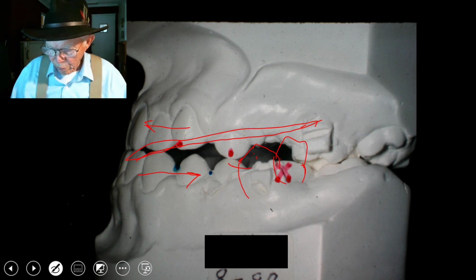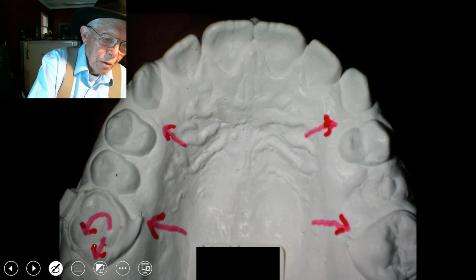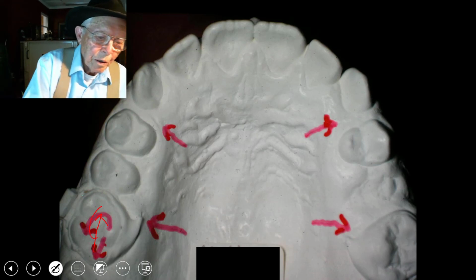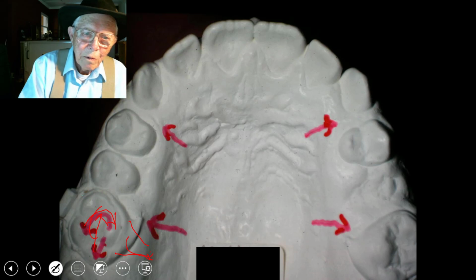So let me go ahead and we'll go through the case and show what actually happens here. Alright, up above, when we look at the upper arch, this tooth right here has drifted in a forward direction. In other words, the tooth is rotated. This rotation sign is wrong. Actually, the tooth went around in this direction, see? And it spun on this lingual root coming off of that tooth over in this direction, spun in that direction.